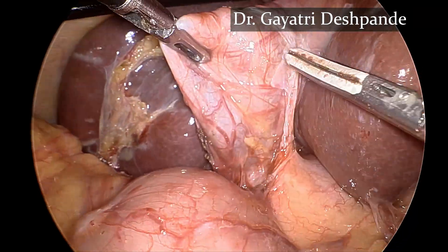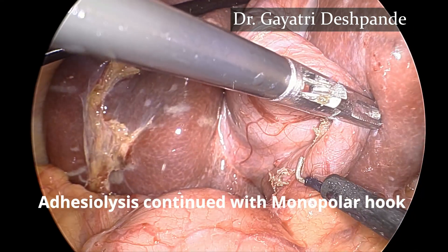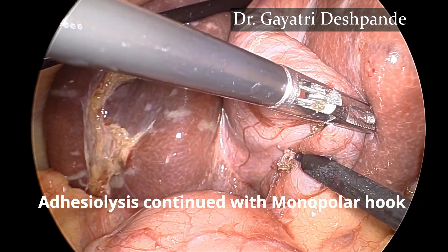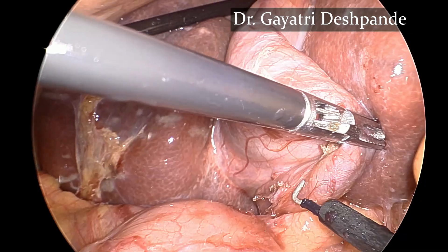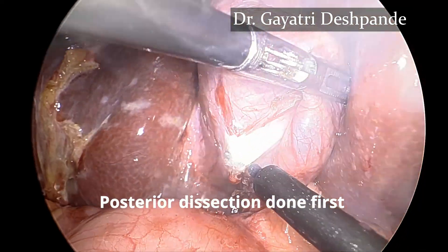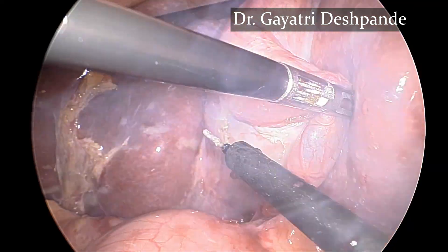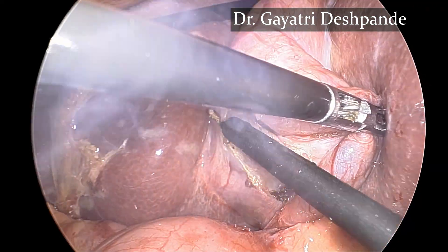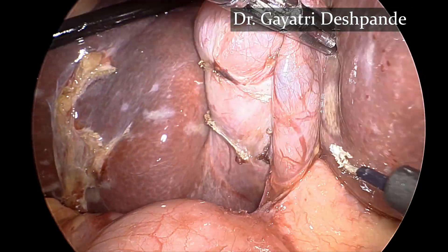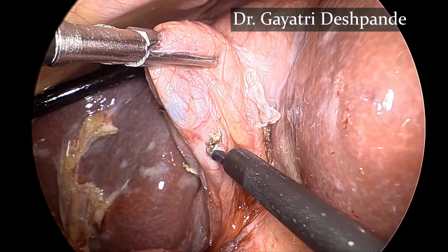Initial visualization is done. The mobilization and dissection of the gallbladder is done using the monopolar hook. The posterior dissection is done first, and then the dissection is continued on the anterior aspect.